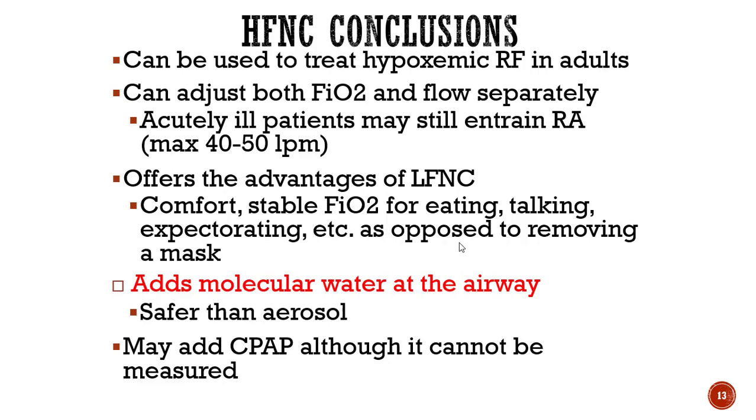Just be aware that if you have a very critically ill patient, a high flow nasal cannula might not actually be delivering a precise FiO2. It might not actually be meeting their inspiratory flow needs. So always be assessing if the high flow nasal cannula is still appropriate for your patient. Yes, they're more comfortable. Yes, patients like them better. That does not mean that they're always going to be an acceptable substitute to the high flow concentration mask.